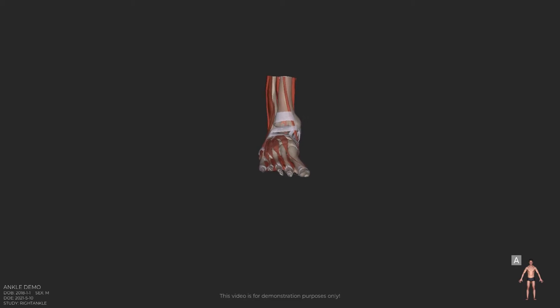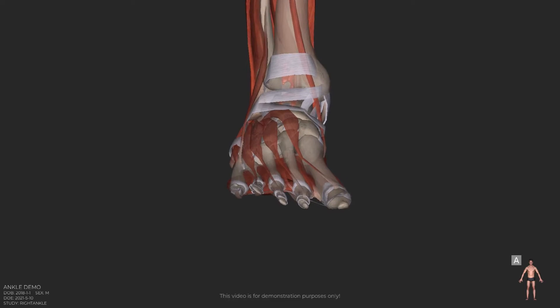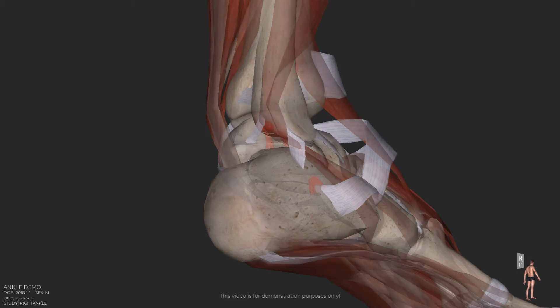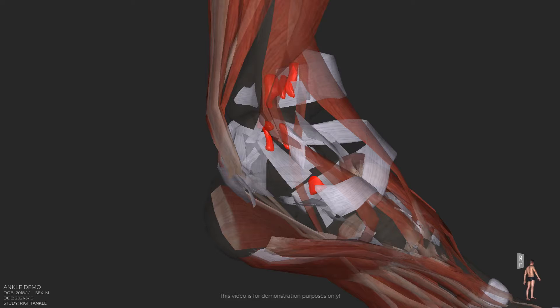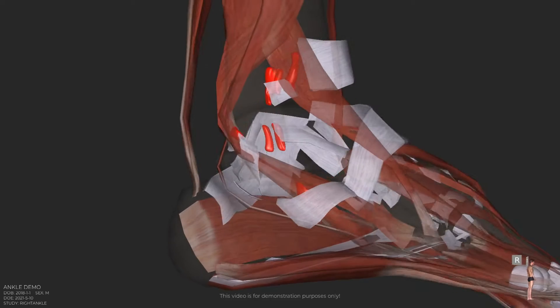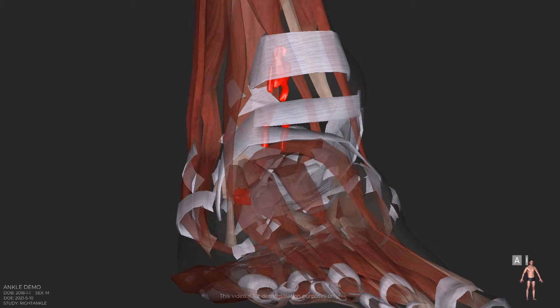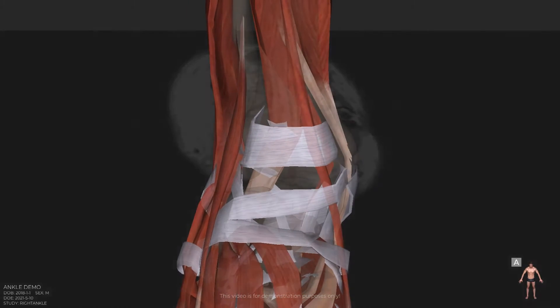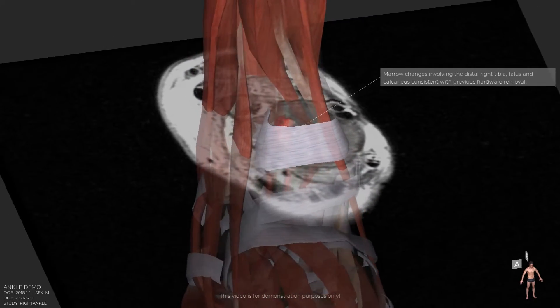This is a video for demonstration purposes of the patient's right foot. Marrow changes involving the distal right tibia, talus, and calcaneus, consistent with previous hardware removal.